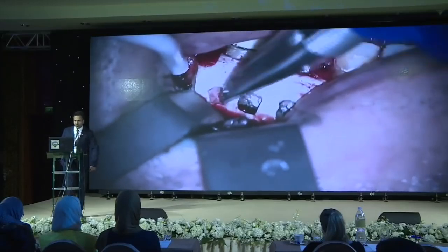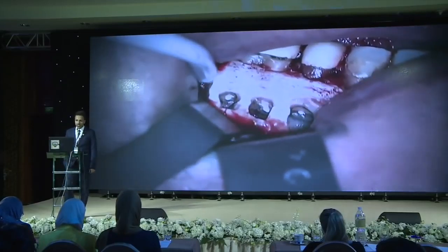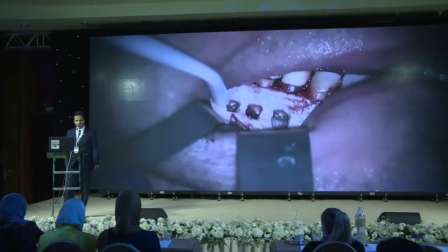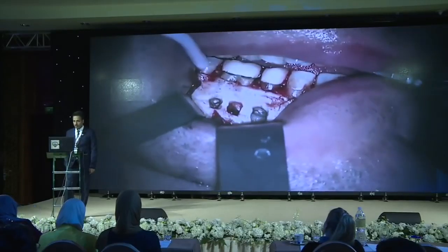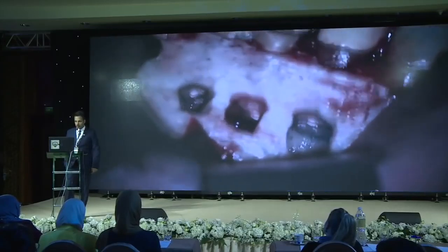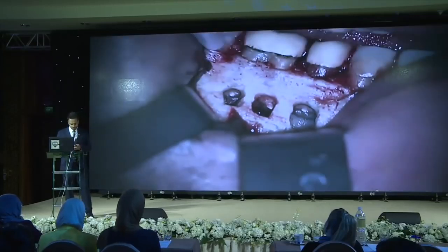So by the end of the procedure, what's good about it is that in the majority of the cases, we don't need any bone grafts or membranes. Because it's conservative, we expect it to heal really quick. And because it's surrounded by bone, we expect the bone to fill it evenly.